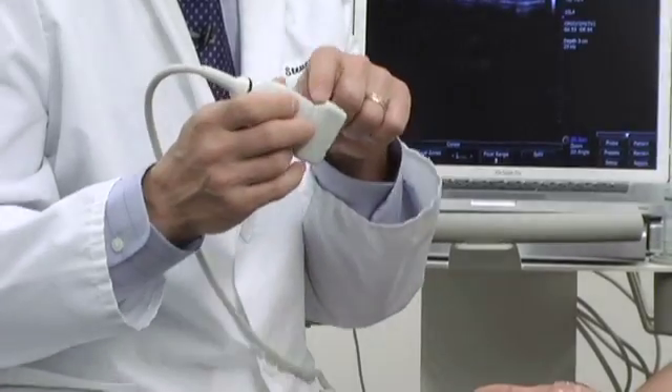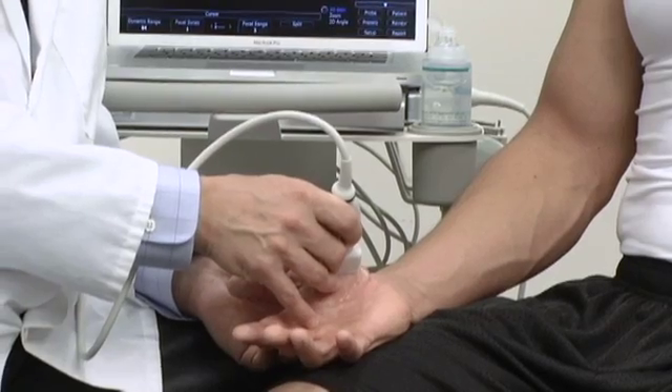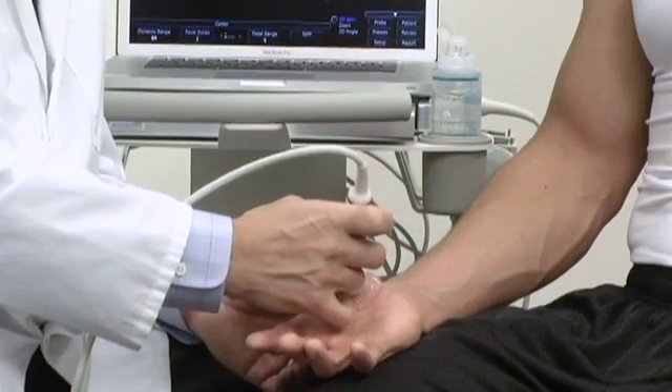By tradition, the notch side of the probe is held towards the patient's head side, or proximally. And when looking at it in transverse, we turn the probe such that the notch is facing towards the patient's right side.